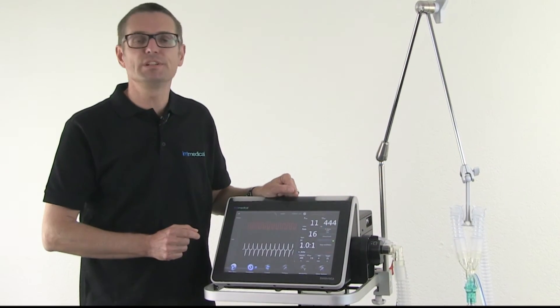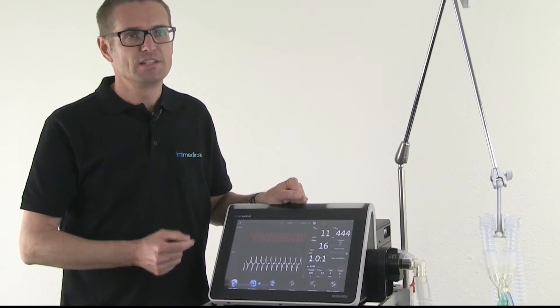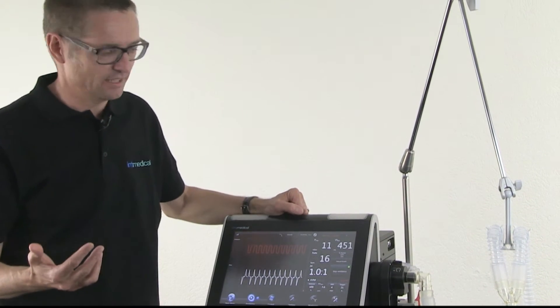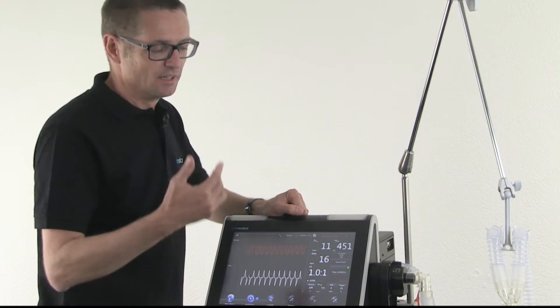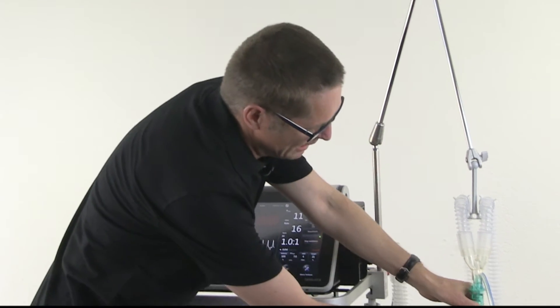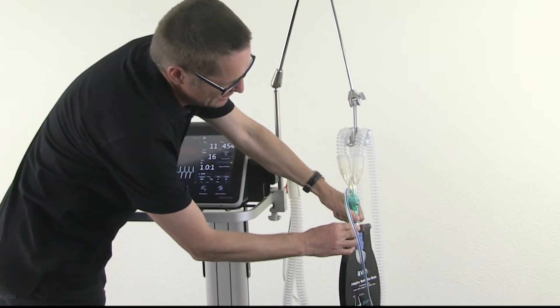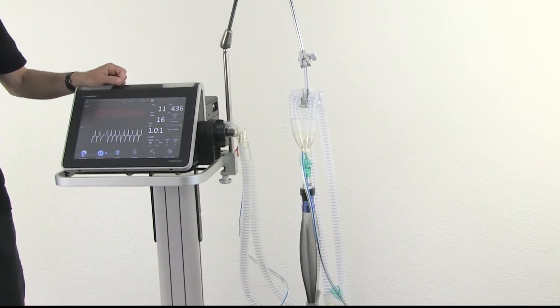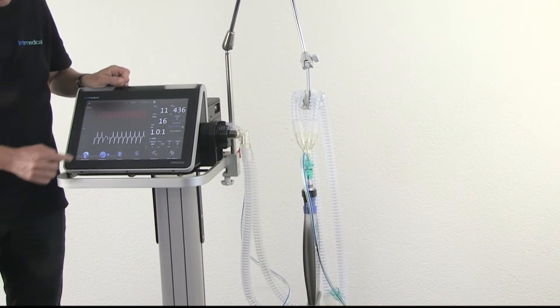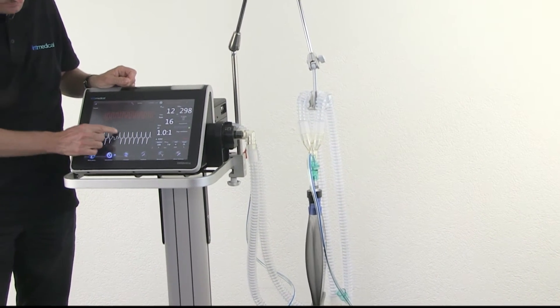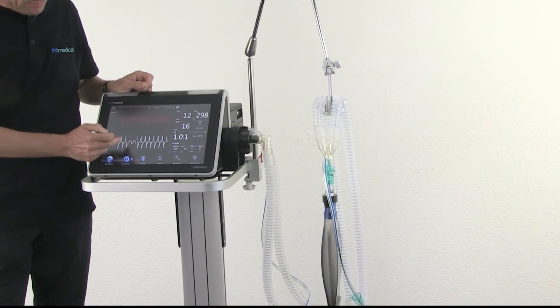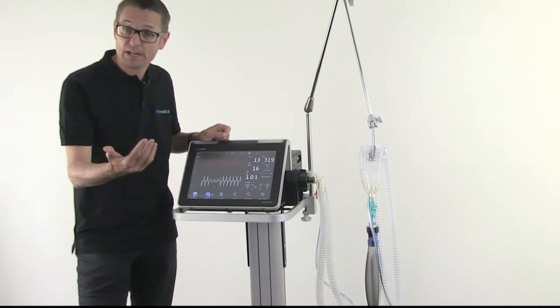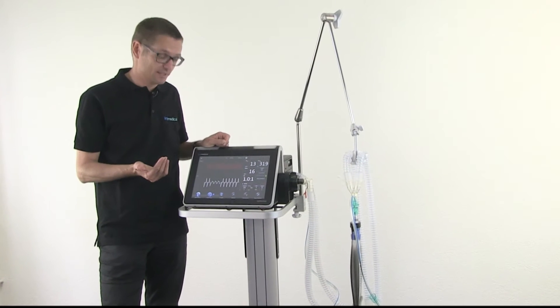Now let's assume this is a COPD patient. COPD patients require more time for exhalation. I increase the resistance of the test lung. You can also see this on the flow pattern — it will require more time for exhalation.